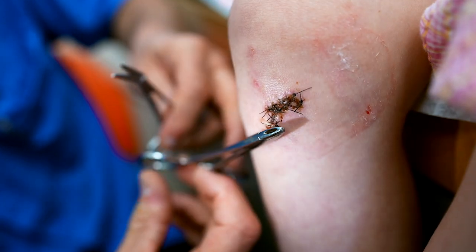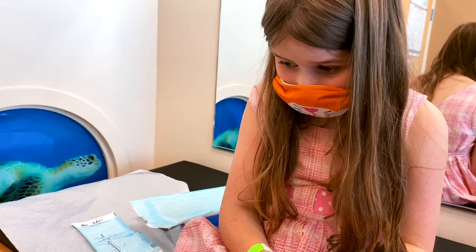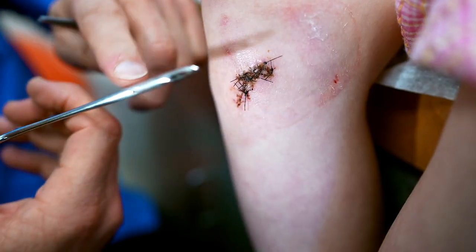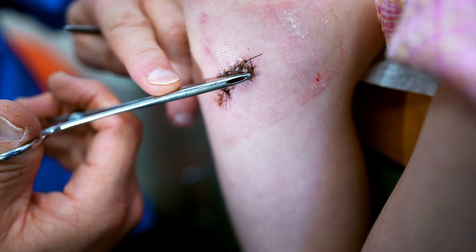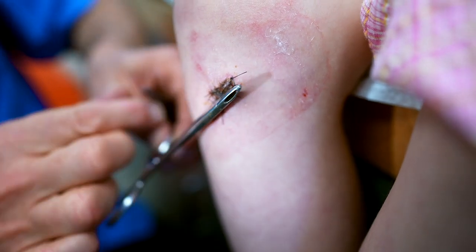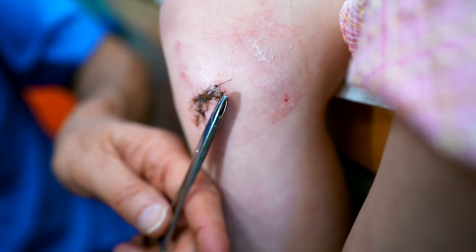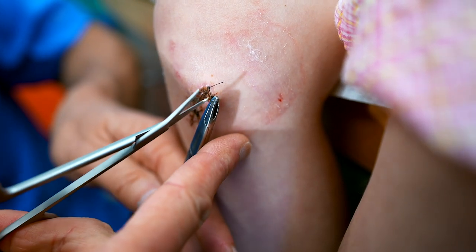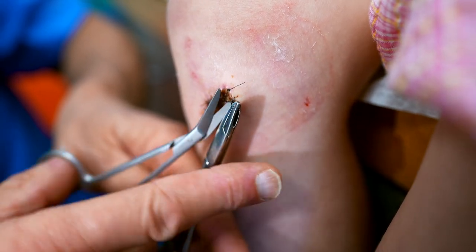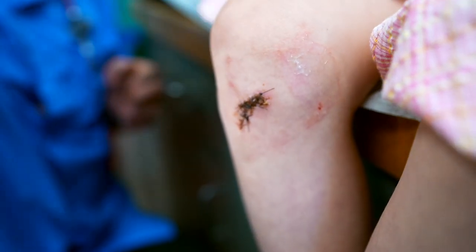So there's another one. It's just funny how they're tangled up. Maybe I'm gonna wait and do a different one first. Let's do this one. You have such pretty eyes. Thanks. That one's tight, tight, tight. Yeah, it is. I had to go pick a tough one. Good job! You did great. That was a tough one.